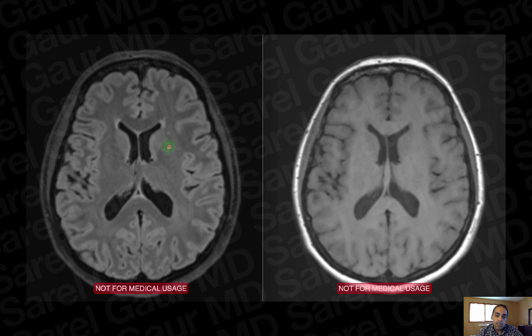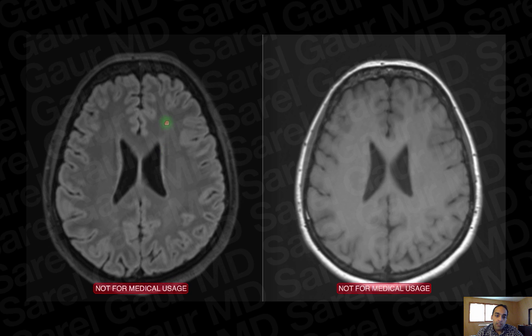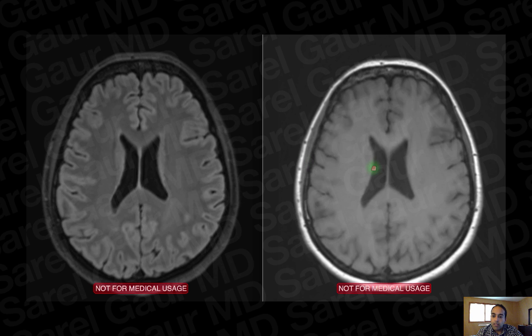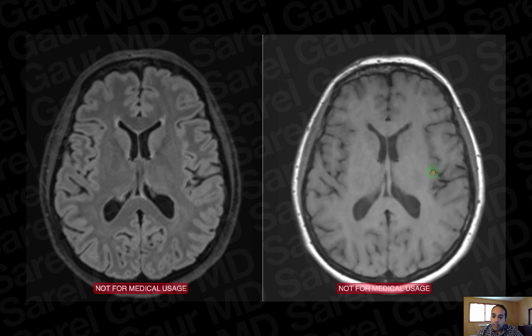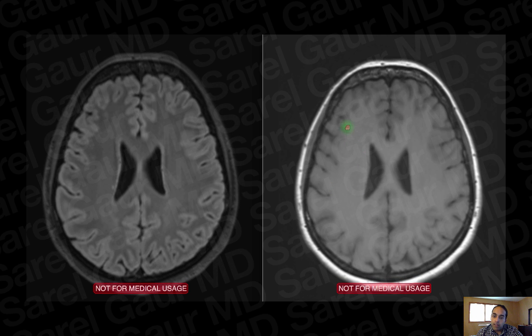The FLAIR sequence is actually a T2-weighted sequence. One way to tell is by looking at the white matter and gray matter — the gray matter is higher in signal and contains more fluid, while the white matter is more fatty because it's myelinated. On T1, the reverse is true: white matter is higher in signal because fat has high T1 signal, and gray matter is darker.